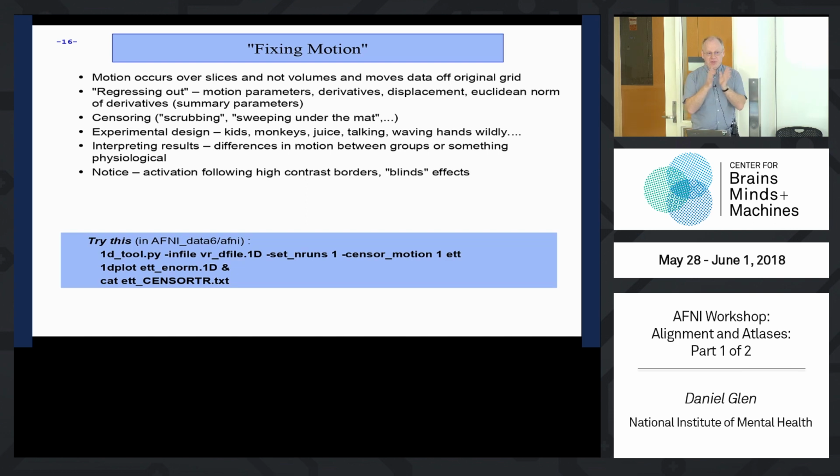Now, if you have a very, very short motion, and the BOLD signal continues on for 15-20 seconds, then you can extract the rest of it. You can say, I don't want to look at the beginning 1-2 seconds, but I'll look at the rest. So it is possible, but in this case there was something like 10 seconds of motion, difficult to do anything about it. It also says, look at your data as soon as you can get it, try to analyze it as soon as possible.